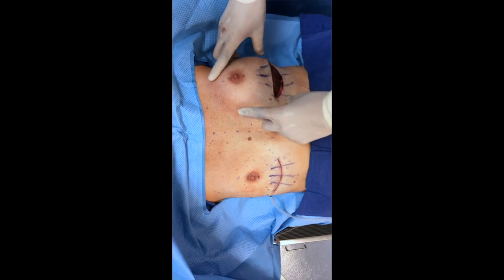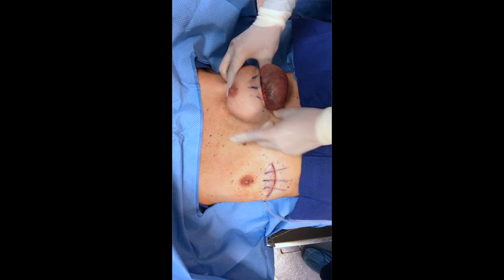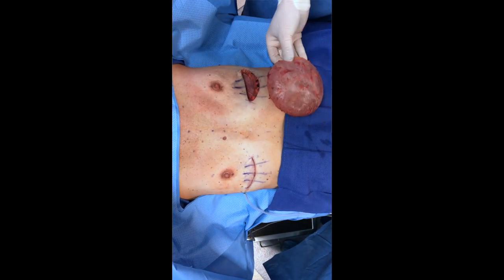In this video I have already performed the en-bloc procedure where the implant capsule complex is separated from the surrounding tissues, and I'm applying a fair amount of force to get the implant capsule complex out — and that nine centimeter incision is barely big enough.